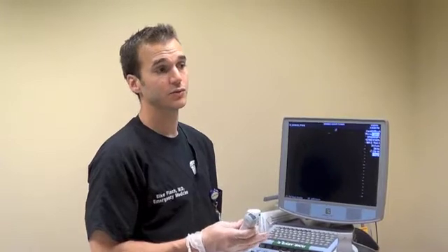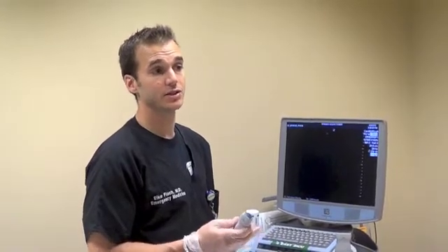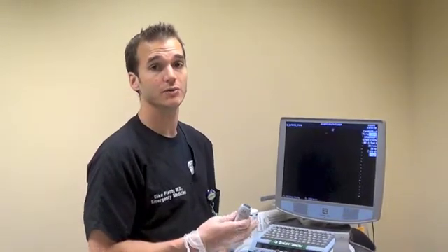Hello, my name is Dr. Iker Flock. I'm the co-director of emergency ultrasound at the University of Florida. Today we're going to be looking at how to obtain a left ventricular short axis view. This is an especially useful view for assessing ejection fraction, but also for evaluating for left ventricular regional wall motion abnormalities.